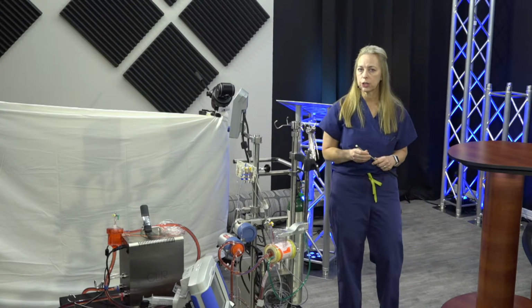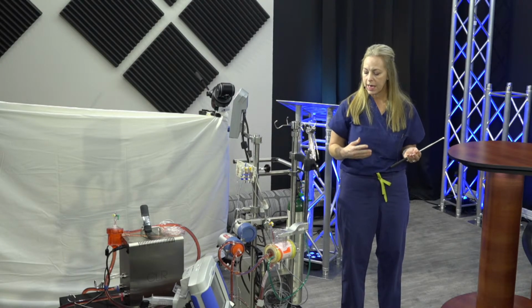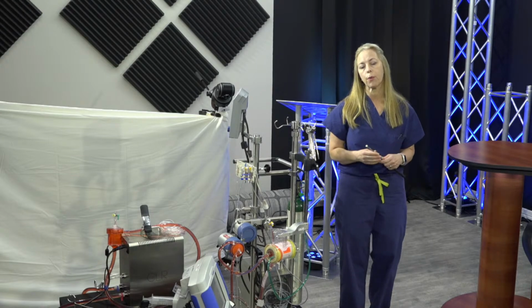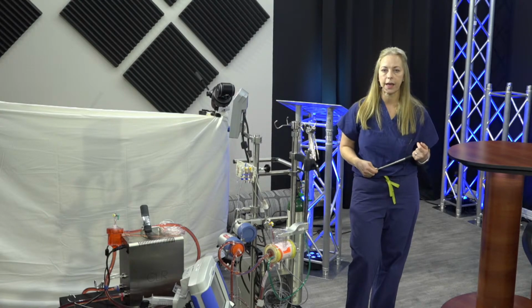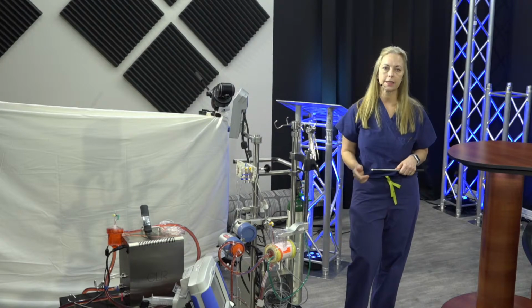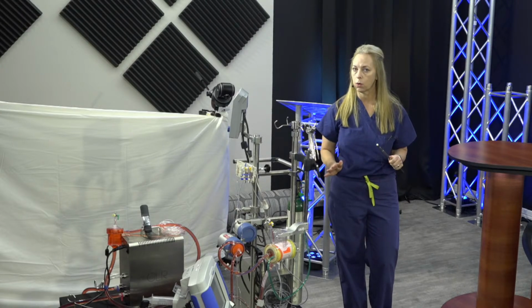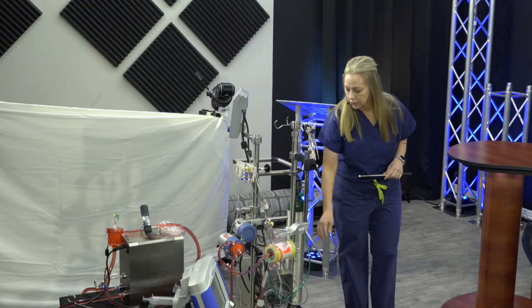But what it can also do is, if it knows your oxygenator blood volume, it can calculate based on the flow how much volume is flowing through your oxygenator. And the reason that's important, of course, is for clot. So we already know as soon as you get on ECMO, very shortly thereafter, whether you're anticoagulated or you're not, you're starting to get some clots. There's always a little bit of low flow stasis areas within these devices, and so we know that that's occurring and that's normal. But what we don't want is clots, which often are on the inside.